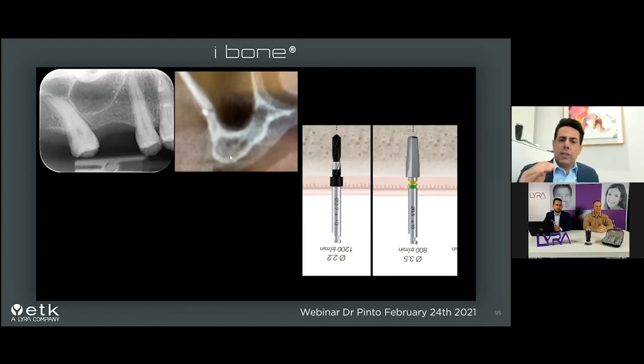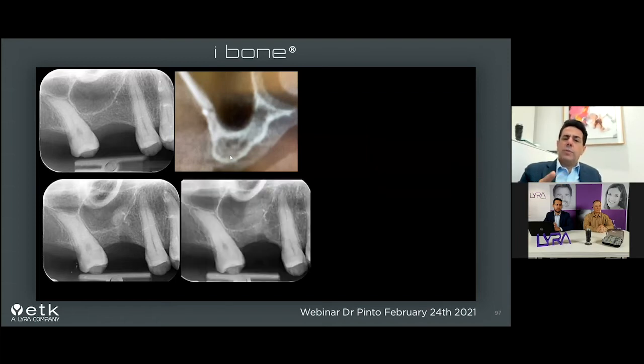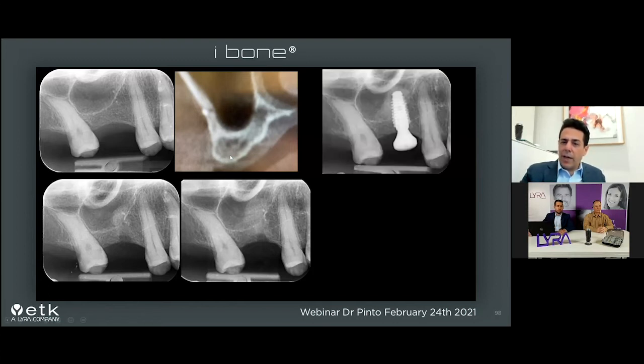And we decide to do exactly like in the previous case. It means the first drill until the cortical, and after the reamer, but you turn it on the reverse side, and now you see that you have pushed the bone and the cortical, and you push it under the sinus, under the membrane. We take an X-ray to be sure, and after we add bone, because it will not be enough, since we wanted to put a long implant. We decided to add bone substitute and to push during the same procedure, pushing the bone under the sinus. And after, we can put the implant directly because you have prepared everything. You have new bone, you did both together.